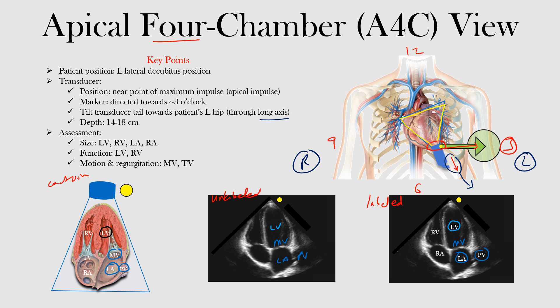We also have the right side of the heart — you can see the right atrium and the right ventricle. Here it is: right atrium, right ventricle. And we know between them we have the tricuspid valve, which would be this one here. So multiple ways that you can view it — we're seeing the four chambers, and we can also see the valves between them: the mitral valve and the tricuspid valve.